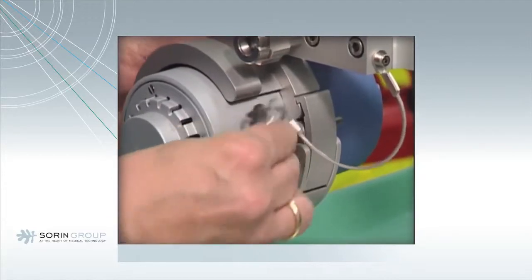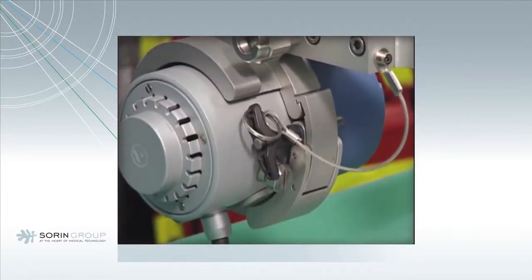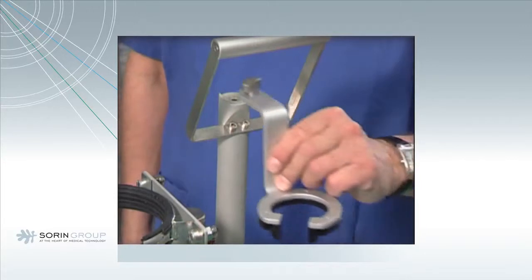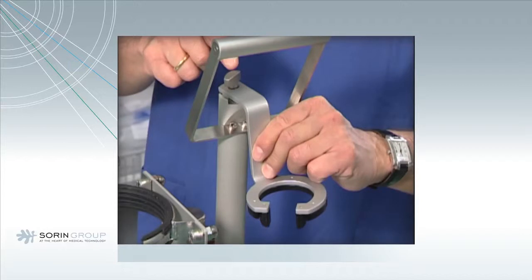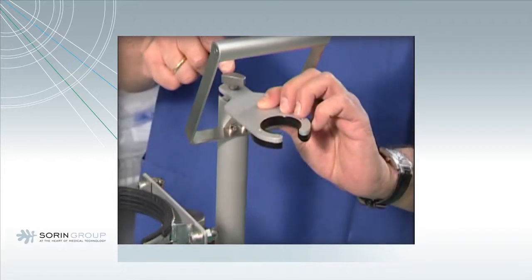Make sure that the silver retaining key is on the top. On top of the holder, there are two different plates available to fix the oxygenator — one for the EOS and one for the Echo 5.